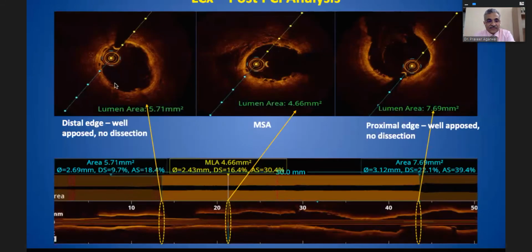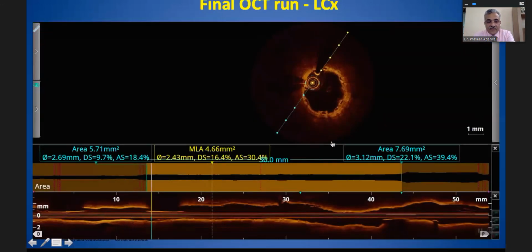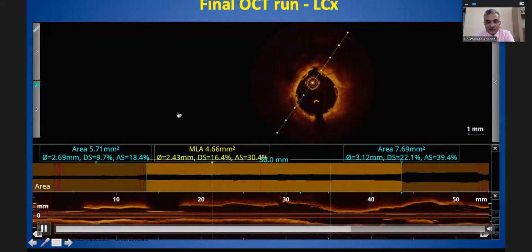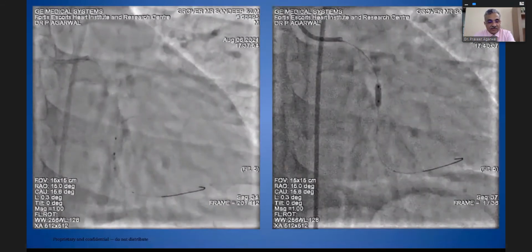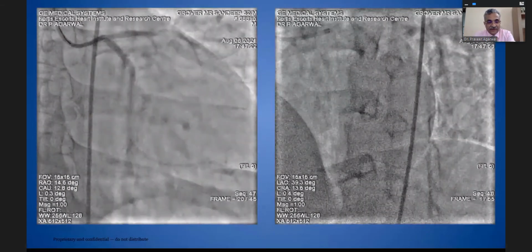You can see the scaffold is very well deployed. I'll show you the running picture. So that will show you the scaffold is very well deployed. But if we just compare the MLA in the center, it is looking less than what it should be. The proximal edge is fine and the distal edge is fine, despite the deployment looking reasonable on OCT. We just went a quarter size up, a 3 mm balloon at high pressure, and the end result is looking very, very gratifying.